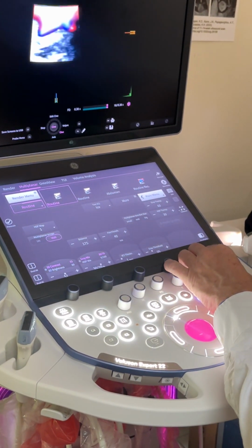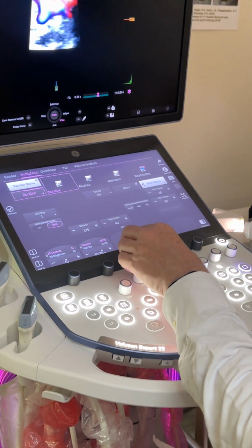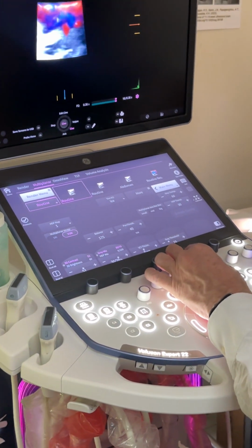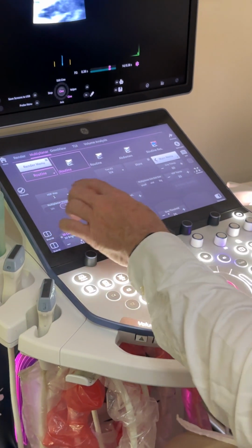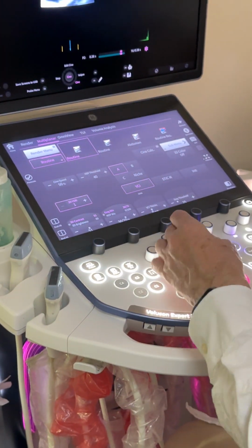So then I magnified my image until I translate through and get it. And then when I do that, I need to increase my slice thickness. And if I increase my slice thickness, I'm more likely to get the whole vessel. I did say it's not a very good acquisition, so I'm not actually catching the whole vessel. It's a very average acquisition. If it's average, I can then go back and do it again.